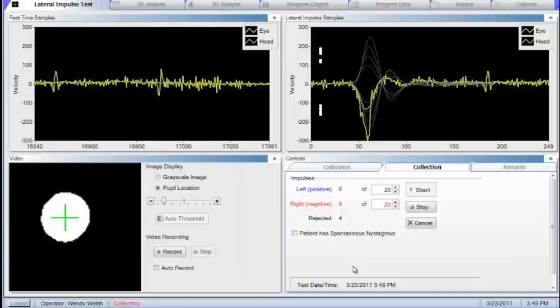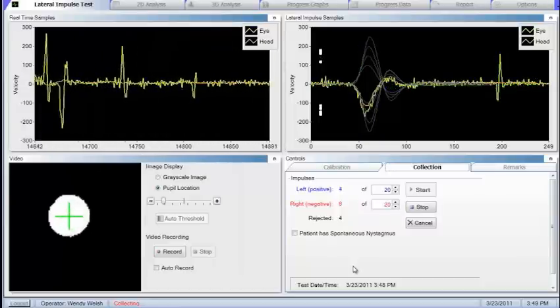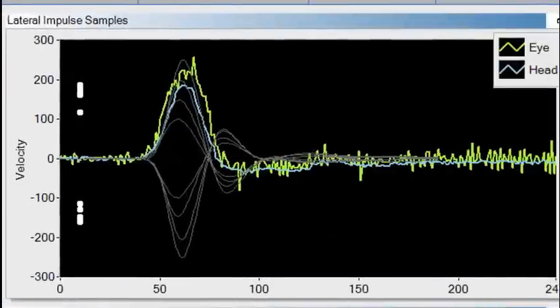There are algorithms built into the system that will reject bad head impulses. While you are doing the head impulse testing, you will want to look at the real time trace window and the lateral impulse window.